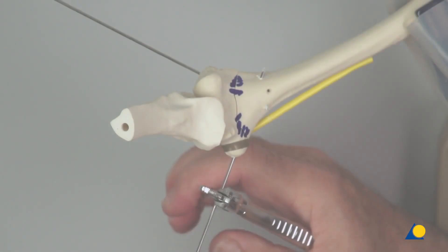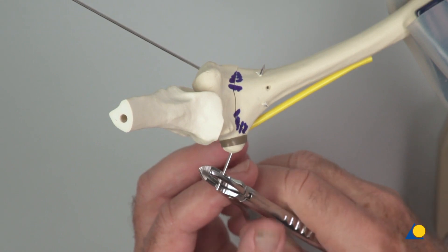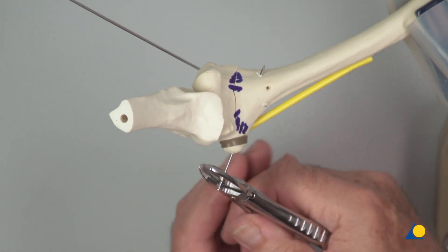The exposed K-wires are trimmed and bent to 90 degrees, taking care not to loosen the wire in the bone.